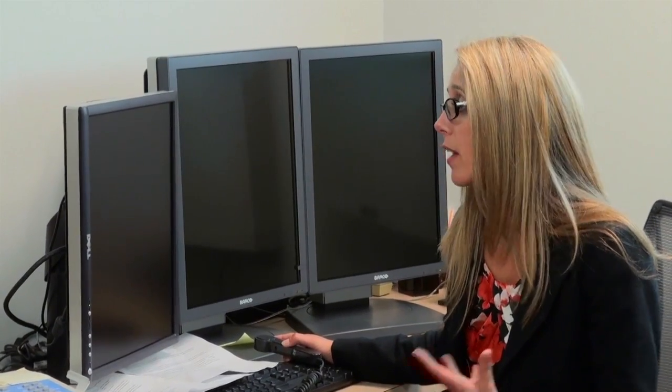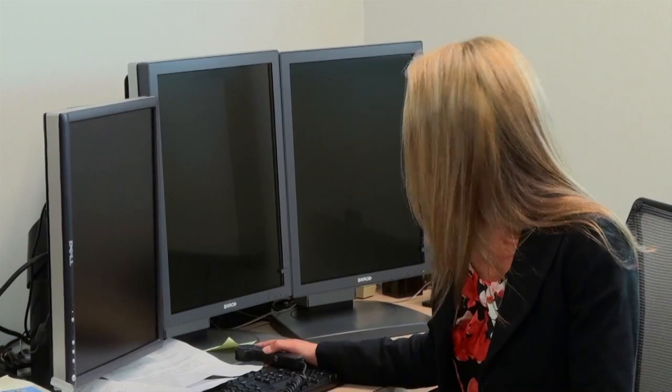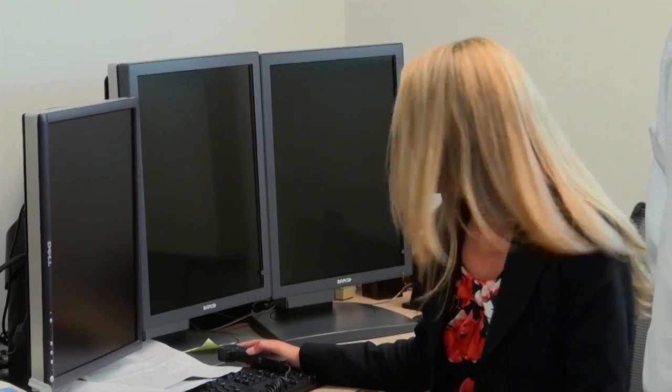So what happens is once the images come in here, I'll look at the images, I will dictate a report into the microphone, and once I look it over and I sign it off, it'll immediately get sent electronically to the physician's office, so they're able to get the results. Oh, excellent. If I do see something that's concerning or out of the ordinary, I'll pick up the phone and I can speak with the doctor who can look at the images at the same time, and we can discuss the patient care at that time. Awesome.